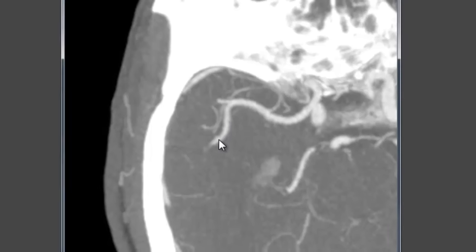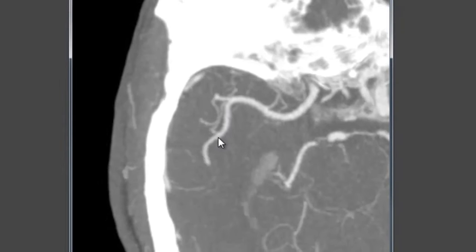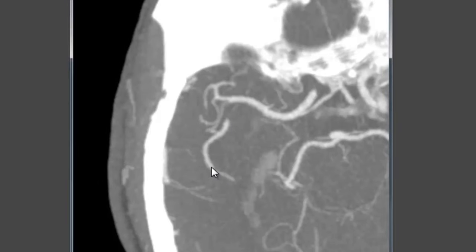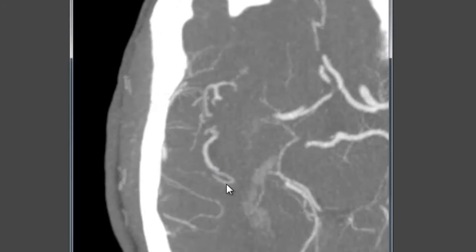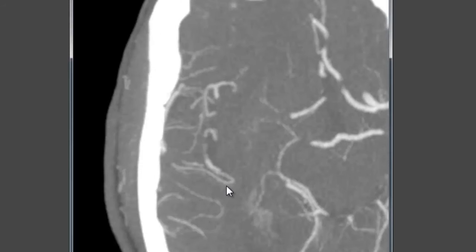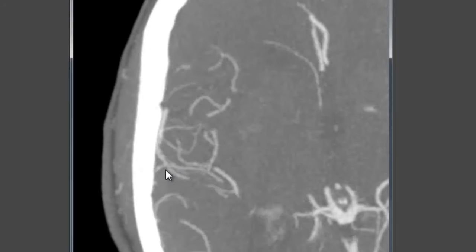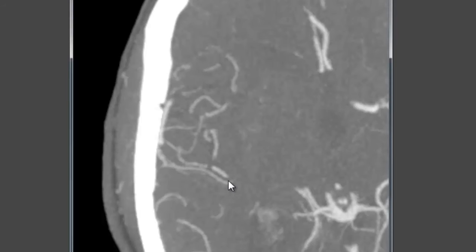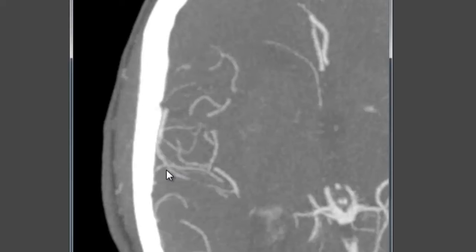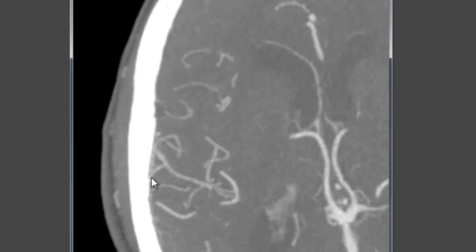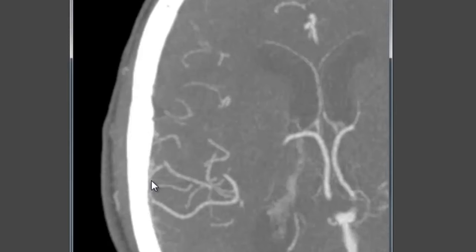Until we start to get turns of vessels into the insular portion. Starting here, this artery is an M2 branch running all the way out — still M2 until its branches start to run out, running horizontally from medial to lateral, this time in the sylvian fissure to reach the cortical surface. Those branches running medial to lateral in the sylvian fissure are your M3 branches, and once they've taken the turn to reach out on the cortical surface, those are the M4s.